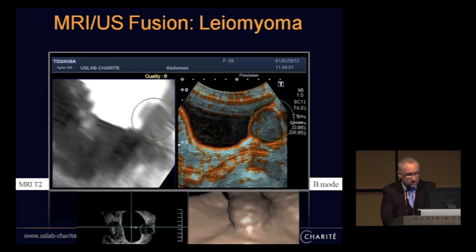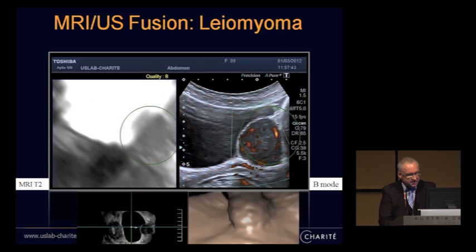We see it's a hypervascularized mass with a round shape. We see it's located near the urethra, and it's very well visible also in the live scanning mode. On your left, MRI scanning, this is the urethra, a very well vascularized lesion. Here's the urethra. This was a leiomyoma of the so-called Retzius space, a very rare case. In a good follow-up situation, the MRI scan was performed 4 years before.